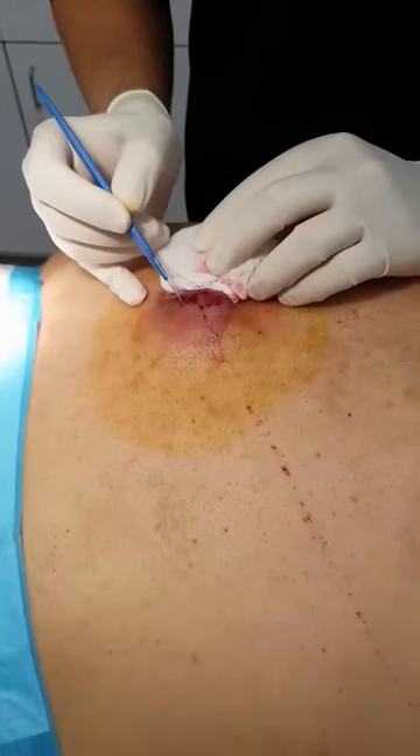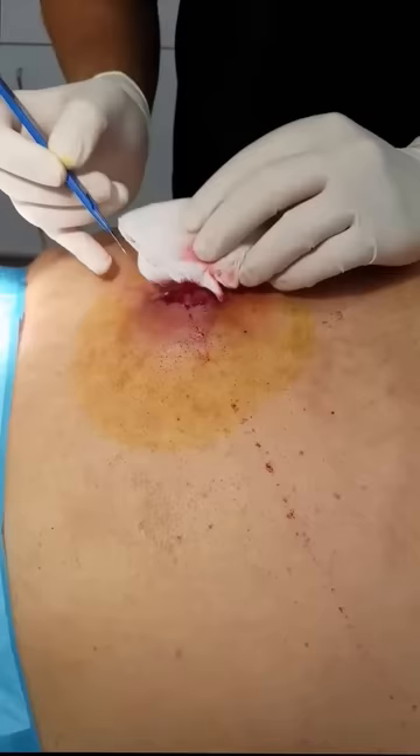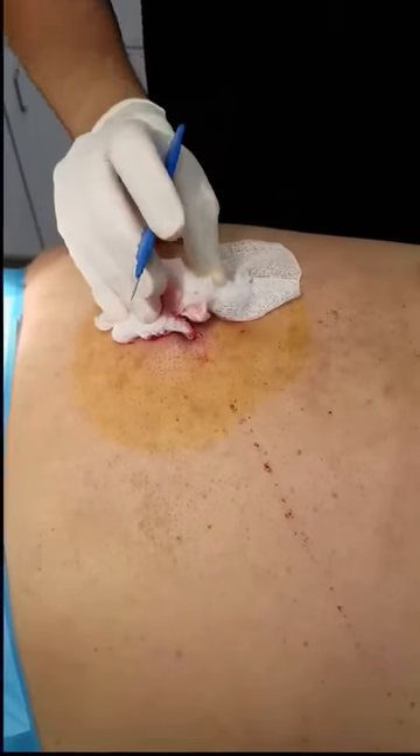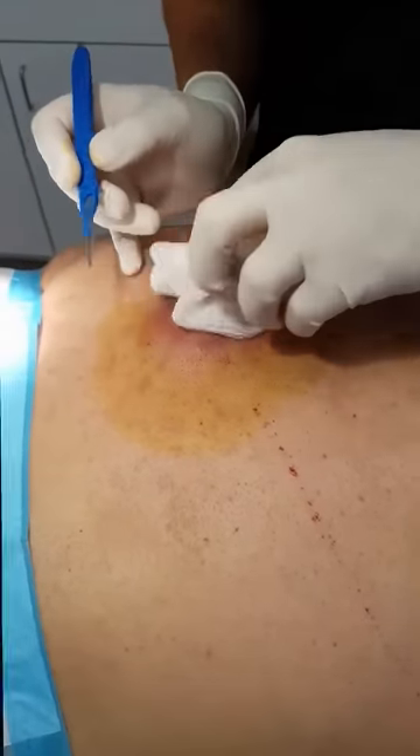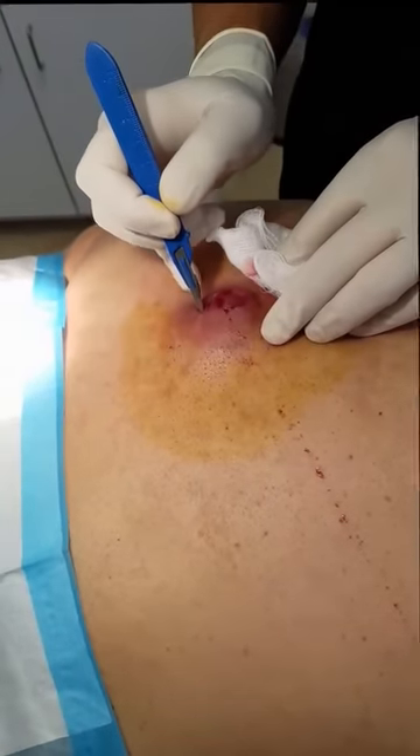You feeling any numbness when I press through here? Yes, now I do. It's numb? Yes. Good. So you feel a little bit of a poke — put a little cut right down the middle of it at the area of most fluctuance.